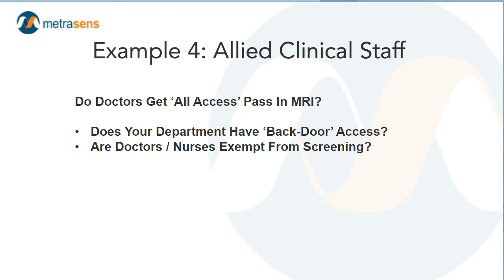So consider whether your MRI department has a staff entrance or an inpatient entrance, a back door, if you will, that allows people to come into the controlled access parts of the MR suite without having gone through the physical spaces that are your operational cues to perform the clinical screening and the physical screening.